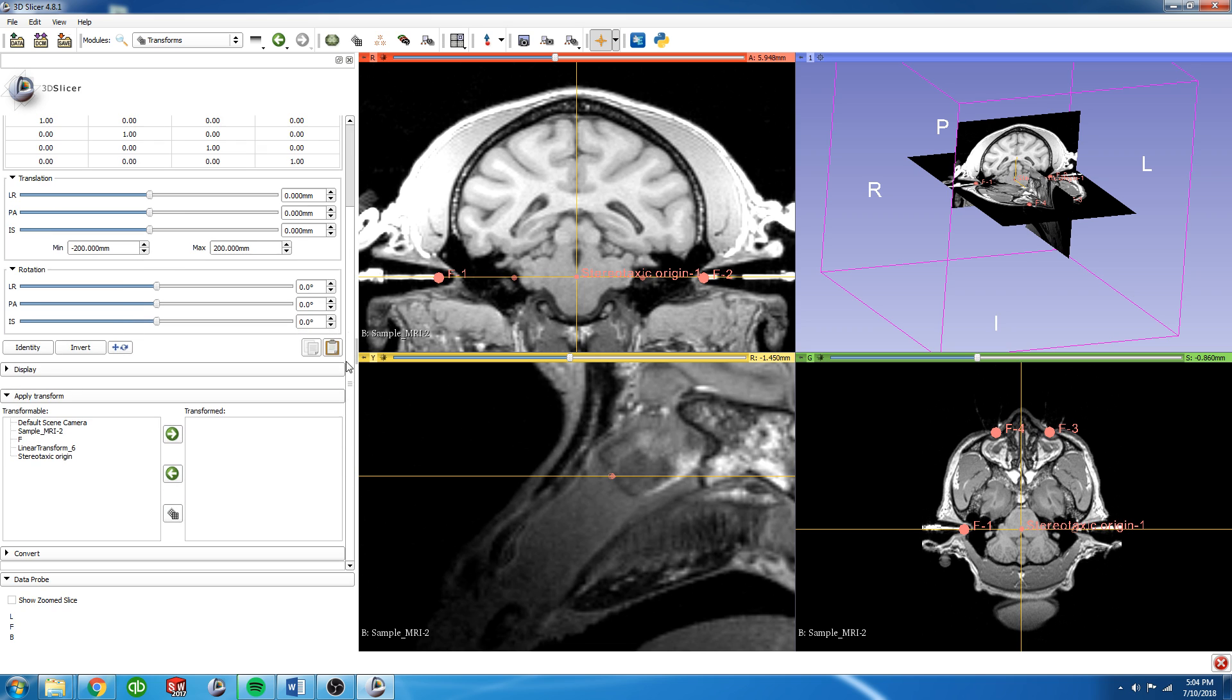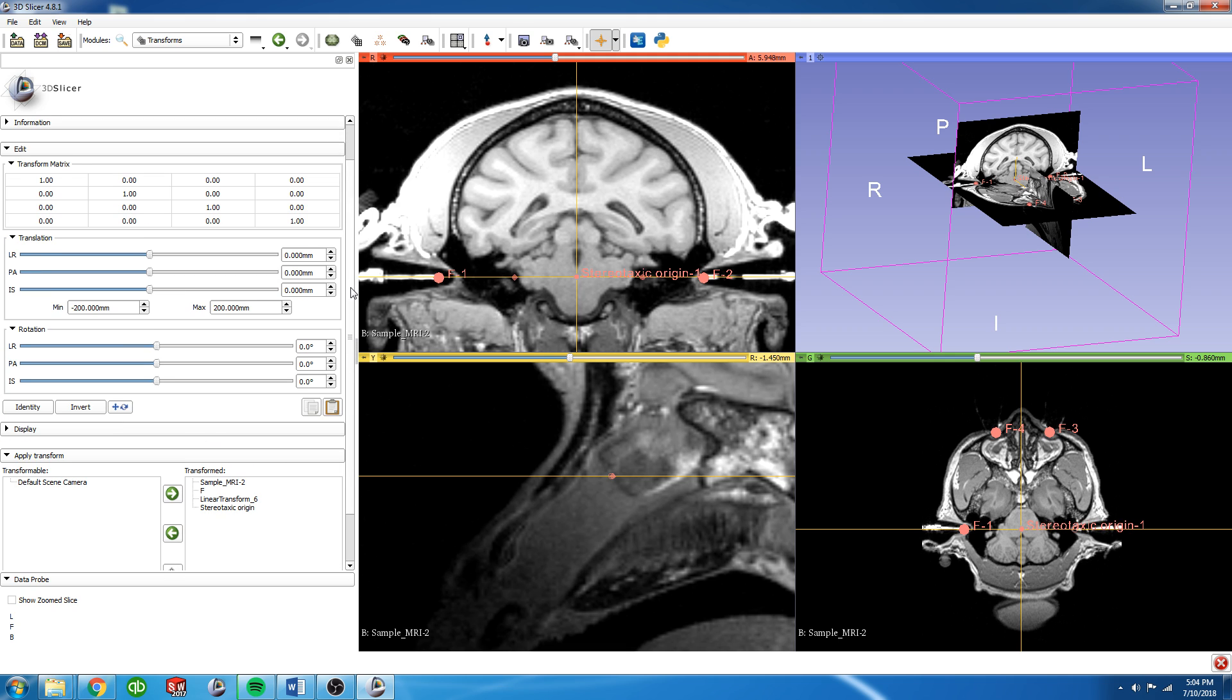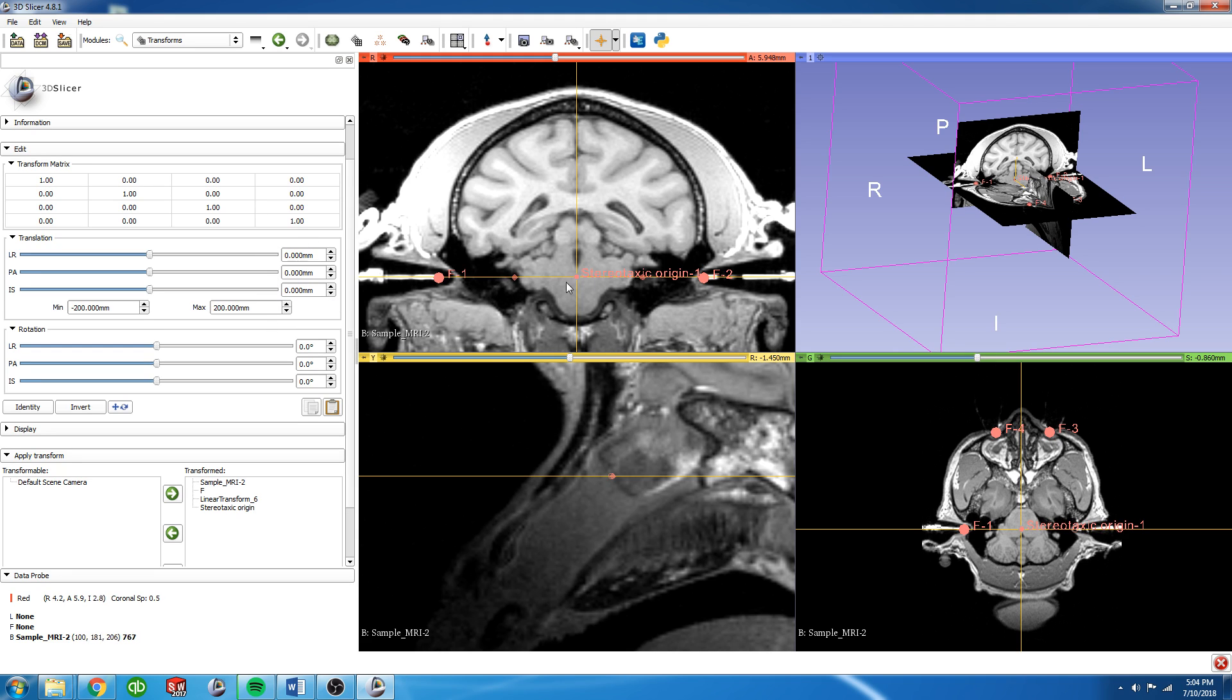From here, we're going to place everything we have right now because we want it all to translate together into the transform box. And we need to do the translation values as the opposite of where the stereotaxic origin is located.